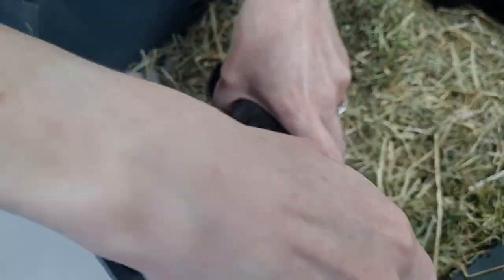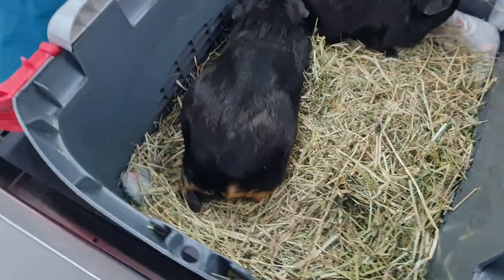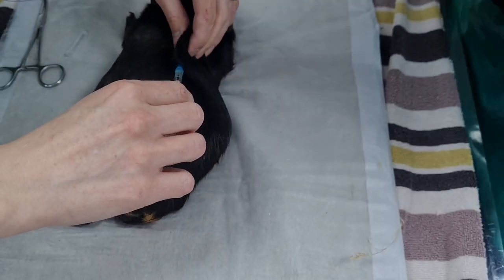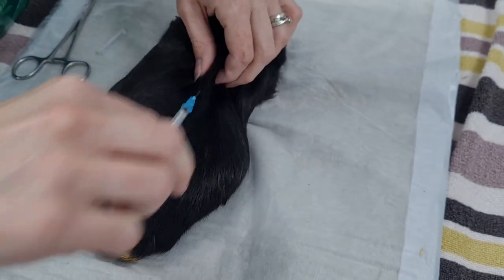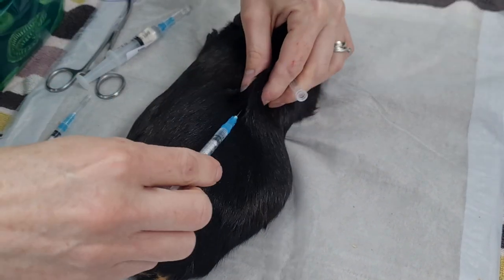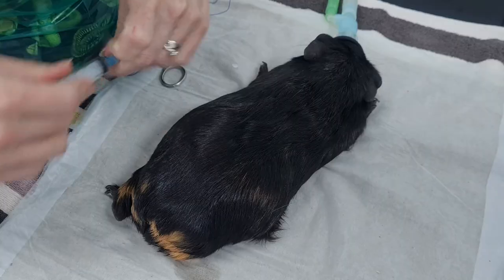We're starting off giving an intramuscular injection of medetomidine, ketamine and methadone, then leaving her back with her sister to go off to sleep. Now Mabel is a bit more settled. She's having subcutaneous meloxicam, maropitant and some fluids, and then we'll settle her on inhaled isoflurane using a face mask.